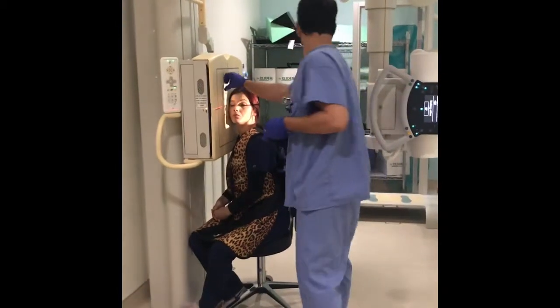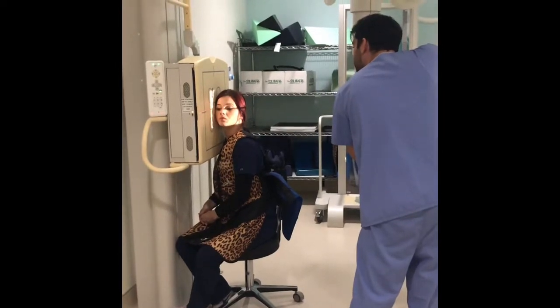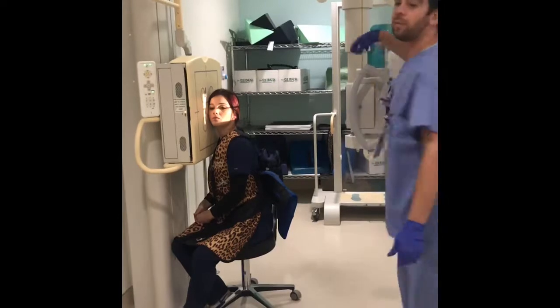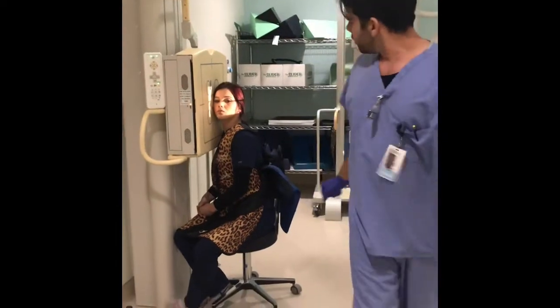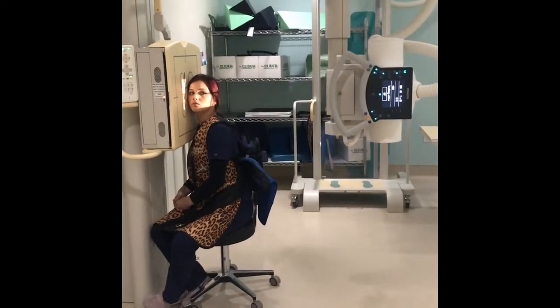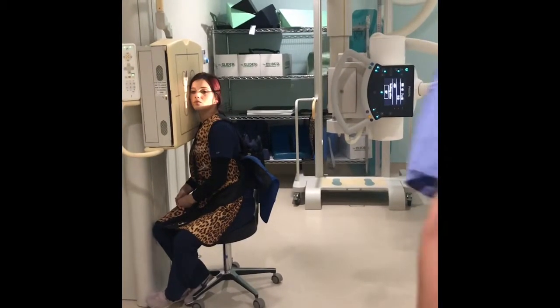I'll be marking it with the right one, and I'll collimate in slightly because we do not need that much skull. Sit right about there, and 75 at 10, maybe 12 at the most would be a good technique. And so I'd say hold your breath, suspend your respiration to limit movement, and X-ray. Okay.